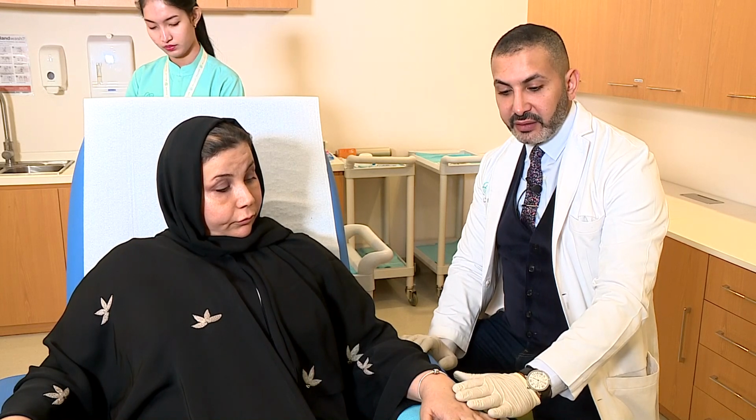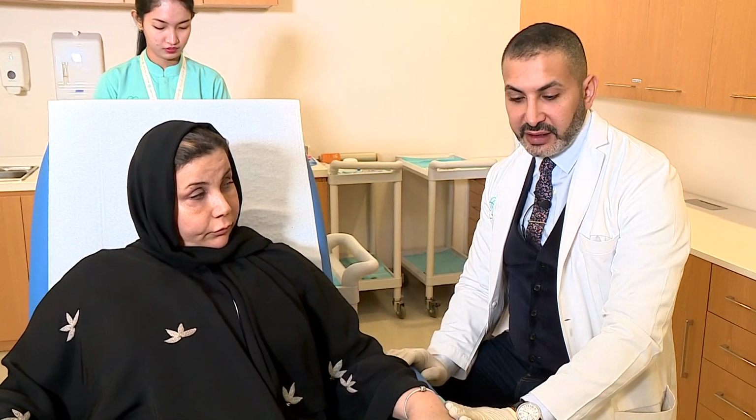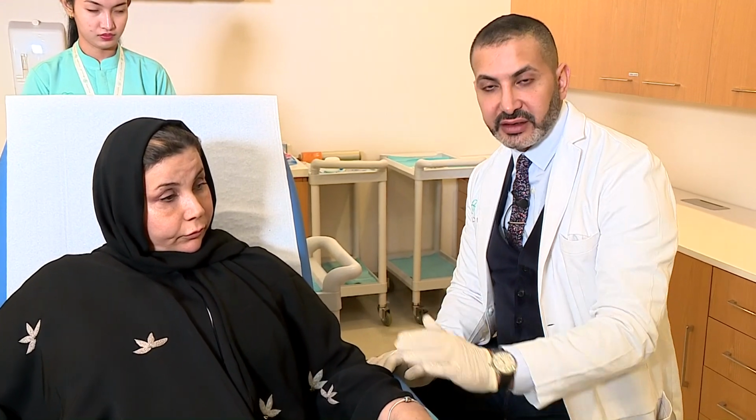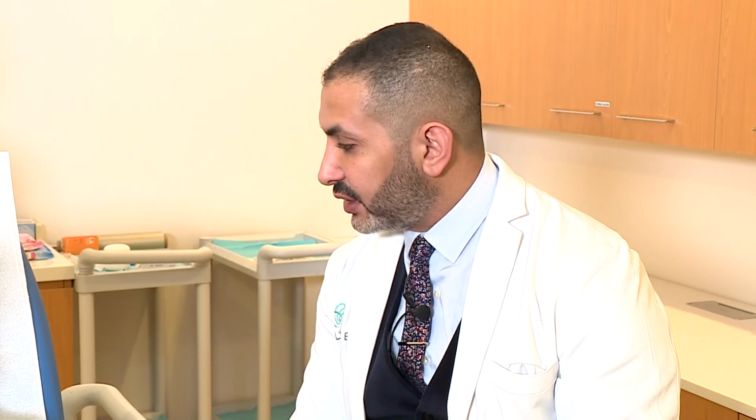In the average rejuvenation hand indication, usually we go with the standard dilution and using one syringe, dividing it in both hands, and then we reassess the patient after some time, and we see if she needs more filling for the hands, more Radiesse in the second session or not. The technique usually varies from one doctor to another doctor. Usually it's easy. All you're looking for in the technique using the Radiesse for the hands is less pain, less swelling, and a good result.